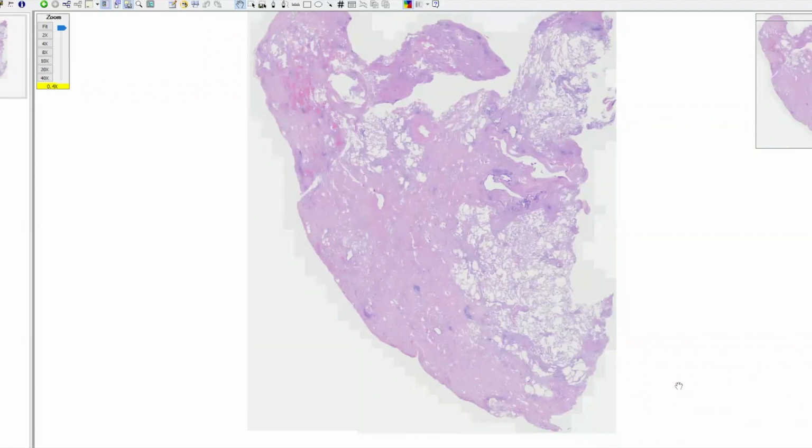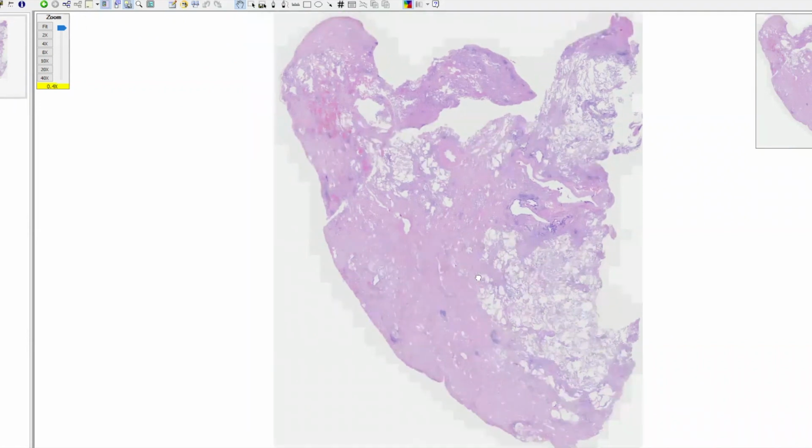The question is, were those structures scolices? They're actually protoscolices because they're not the full worm. They're the more juvenile form of the worm.